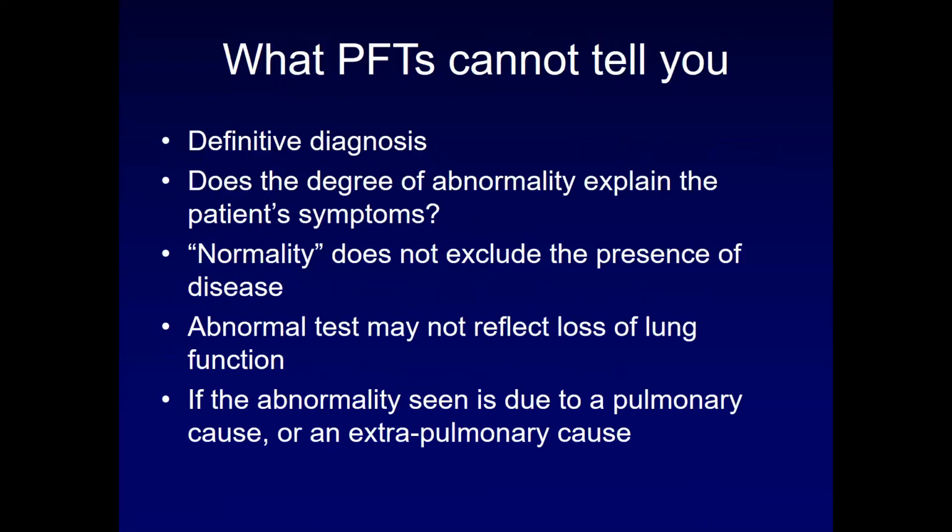Okay, so now that I've completed telling you what PFTs are and what they do, I'm going to tell you what PFTs cannot do. They can't give you a diagnosis. They can show you a pattern, but they can't give you a diagnosis. They can't tell you if the degree of the abnormality explains what the patient's symptoms are.